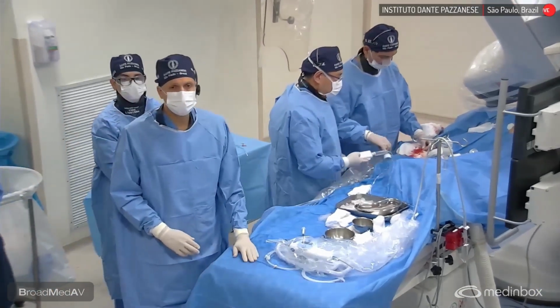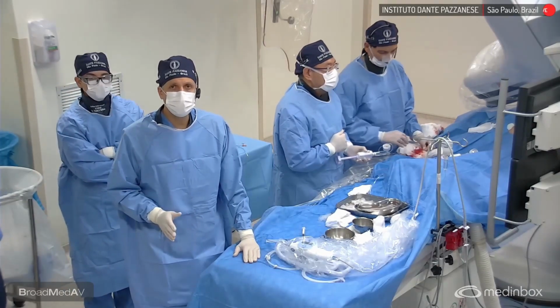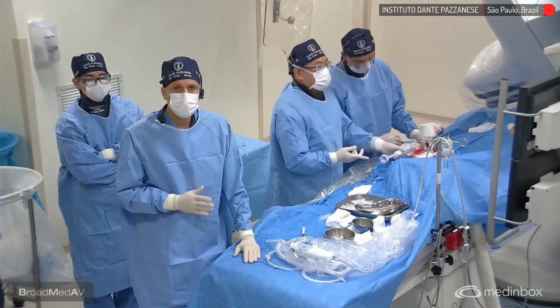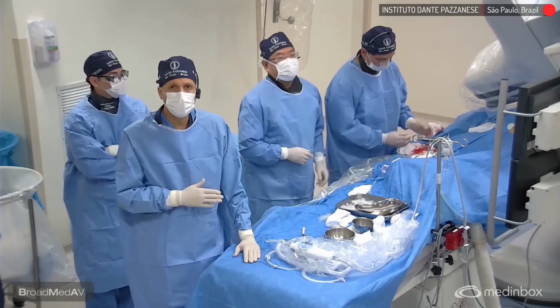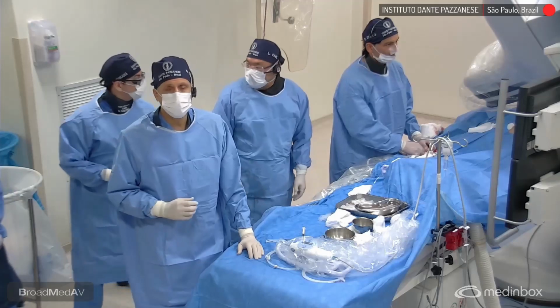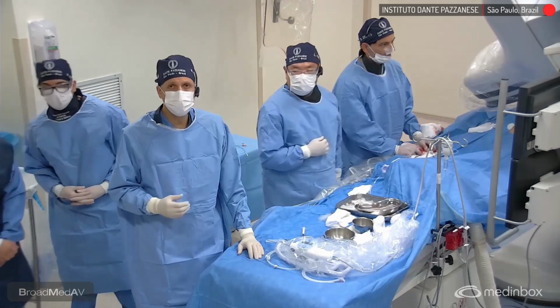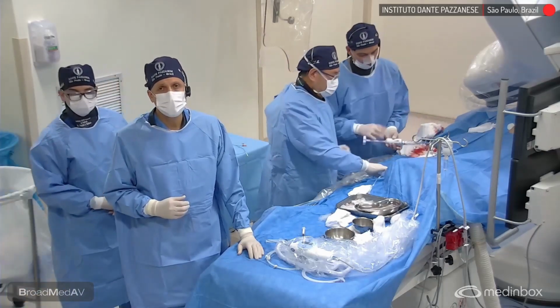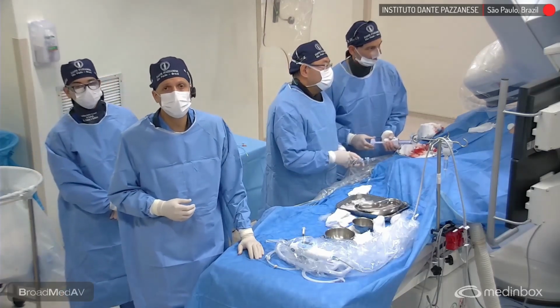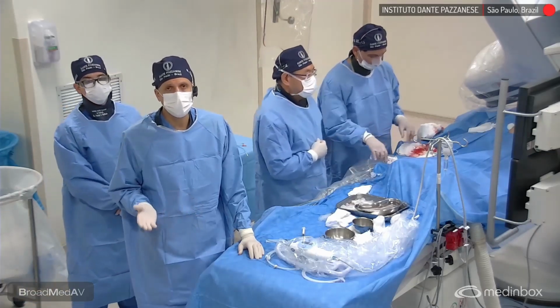So this case was, I would say, a very challenging case. This was a patient 73 years old. The first episode of chest pain was a week ago. The patient was on a flight. He came back to our country. He had an additional clinical event, and after that he came to the ER of our hospital and was diagnosed with ACS, unstable angina.